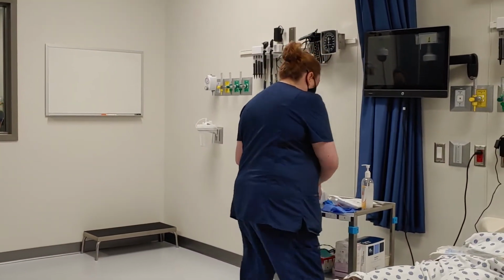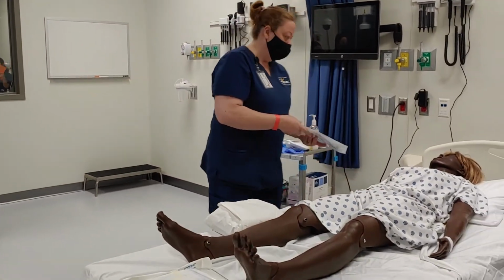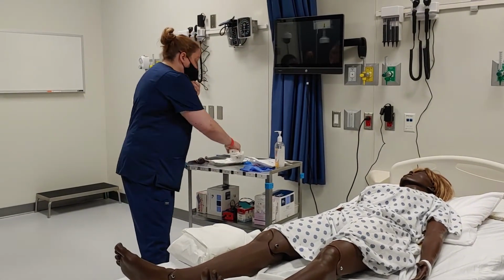The one that I'm going to be using is a Foley kit. So I'm going to have this here. Again, I've already talked to my patient. I've identified them. I've identified myself. They understand the procedure. They know there's going to be some pressure with it.